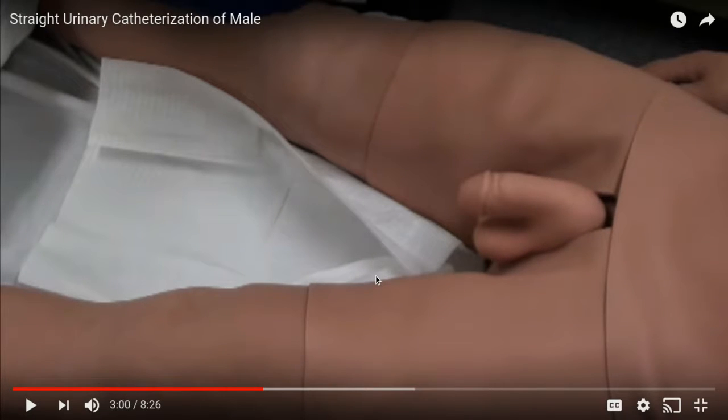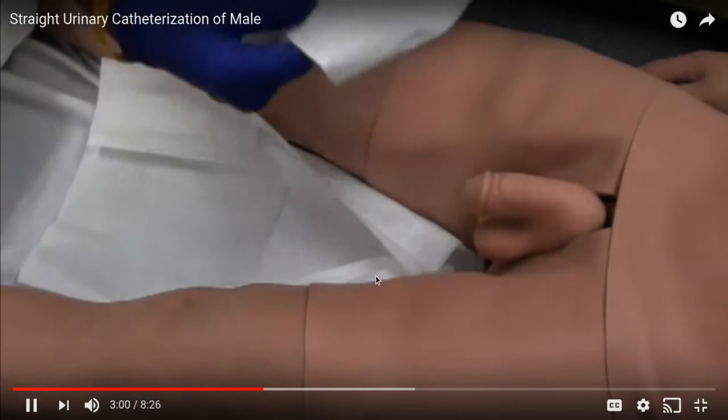Now, as you can see, when he is touching things with his non-sterile gloves, he's only touching what he needs that would not be sterile anyway, which would be the drapes, the covers, and those kinds of things around the penis.